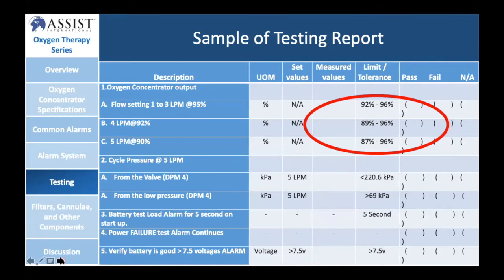For your technical teams, I just wanted to put this resource out there. We've got extensive maintenance checklists that are available that we use for training when we train technicians and biomedical engineers. And so we've highlighted just 3 quick things that I'm happy to share with you.